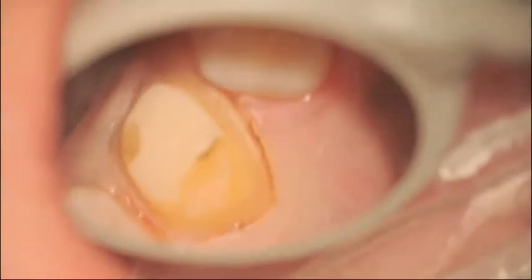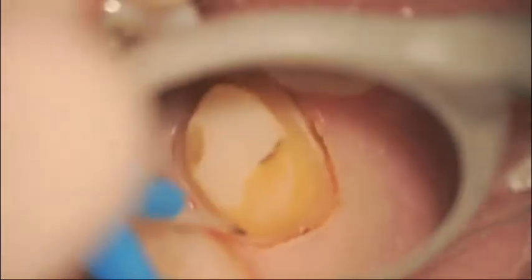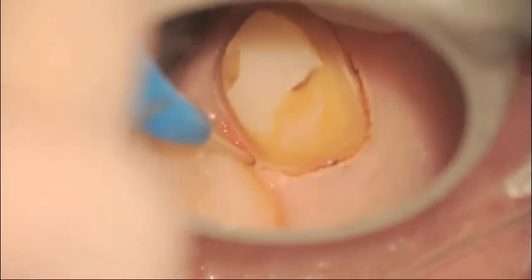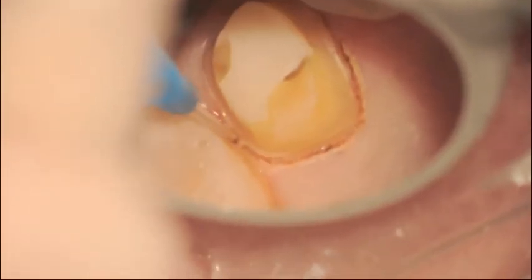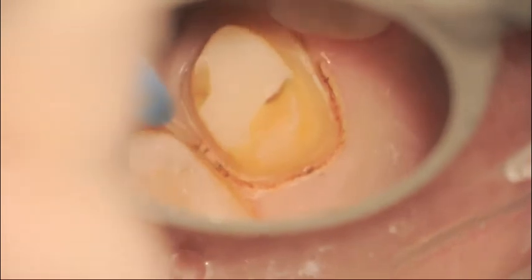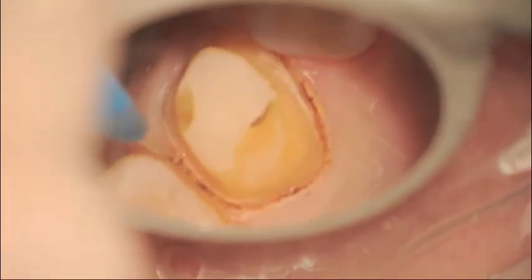Short brush-like strokes. You're not trying to go deep into the sulcus — it's just half a millimeter or so. If you notice the angulation of the tip, the tip is always at about 60 degrees to the margin. You can see, in fact, on the distal that perhaps I had not created enough space for the diode, which is a 400 micron tip, to get in between and really create a nice sulcus there.